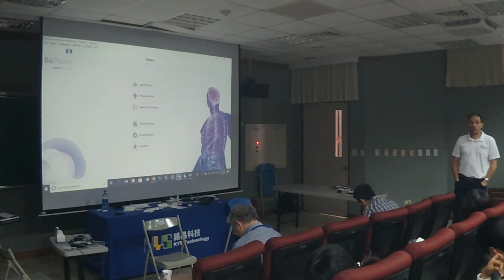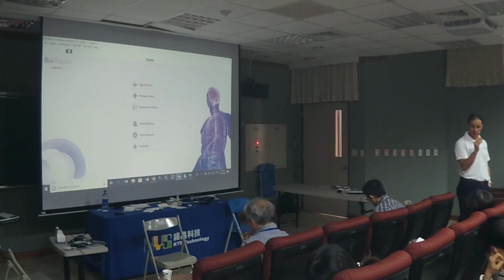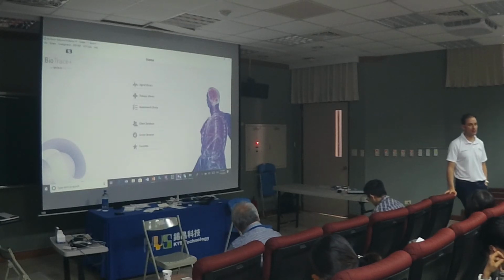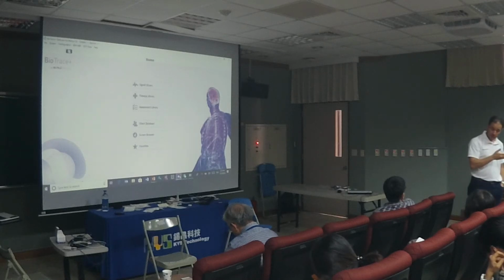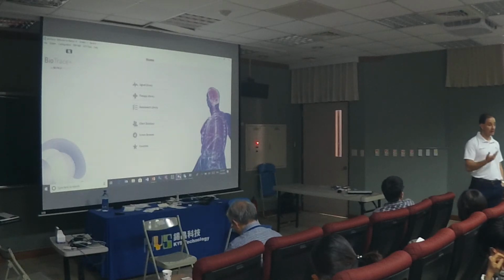the next thing is what type of protocol do you need? You can do 1 protocol for 20 sessions, or you can do 2 different protocols taking turns. For instance, let's say you have a client with anxiety and ADHD. So for the ADHD, you can either do the traditional CZ training, theta beta, theta SMR, right? And then for the anxiety, you want to do PZ. So 1 session you can do theta SMR, the other session you can do PZ. That's absolutely fine. Don't be afraid to combine protocols.